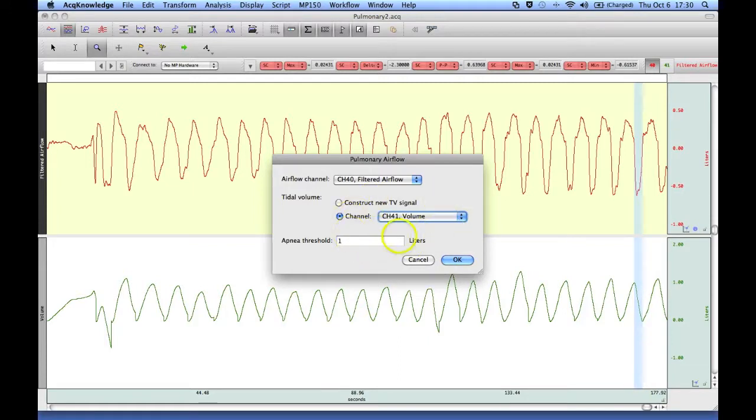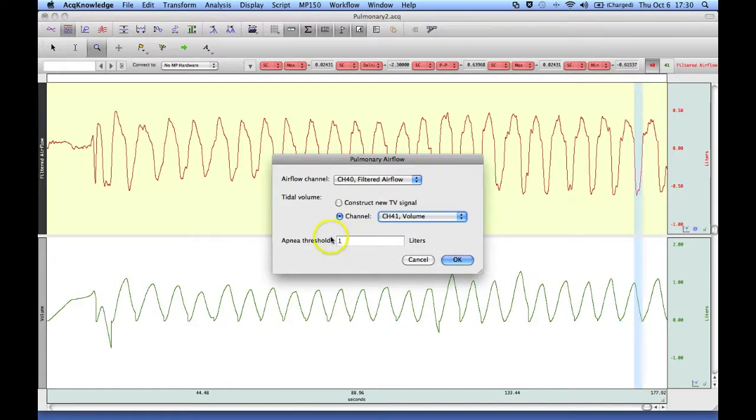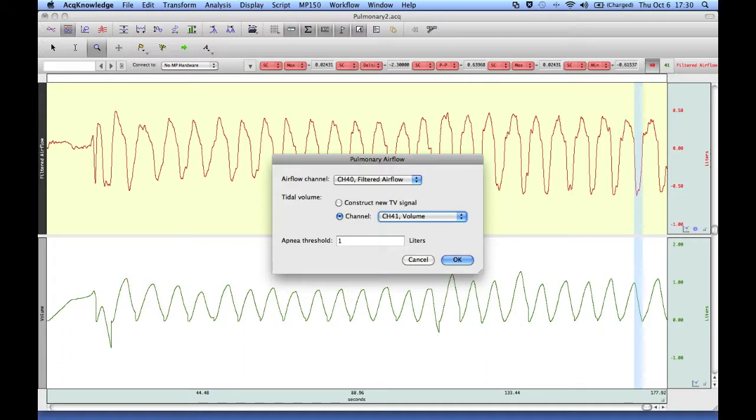And then the important part is making sure that you're going to set the threshold to the appropriate level. Now you can use a threshold of zero here. And each time the airflow signal crosses zero, it will identify the signal going positive as the beginning of an inspiration.